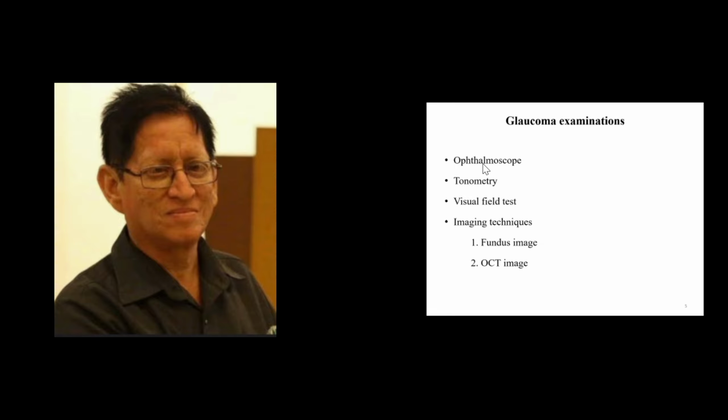Based upon all the tests, the doctor may conclude whether glaucoma is there or not. But all these tests are invasive tests. So now we are moving to non-invasive tests. It is called the imaging technique.